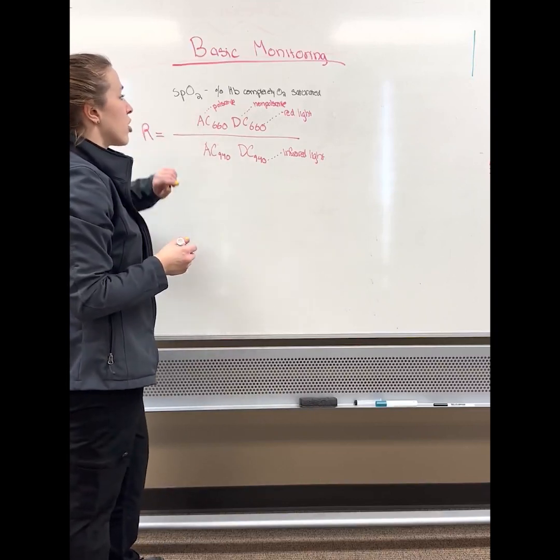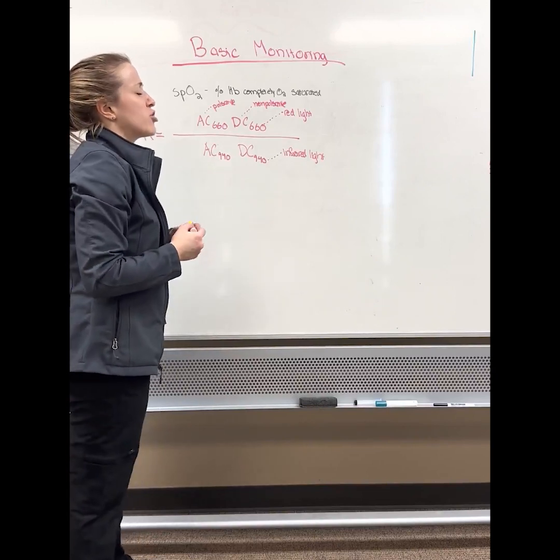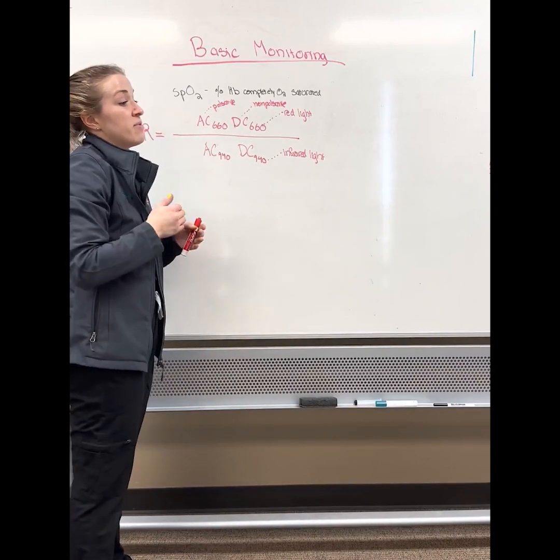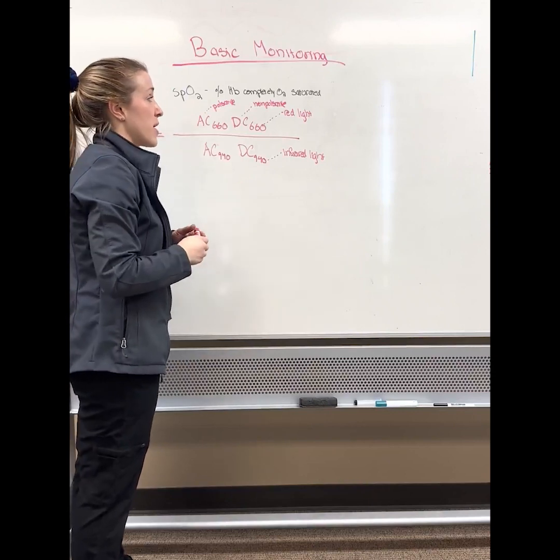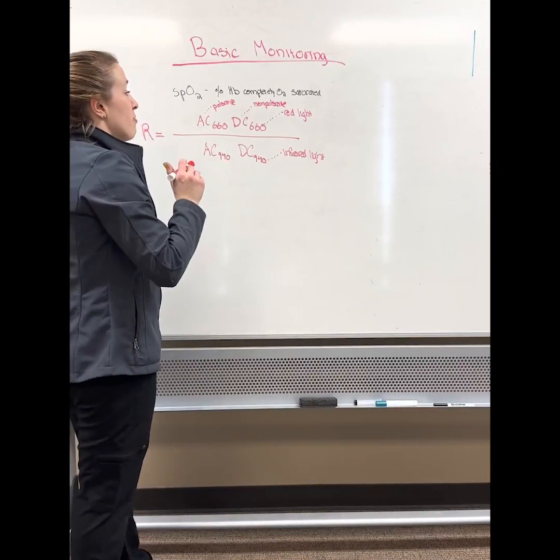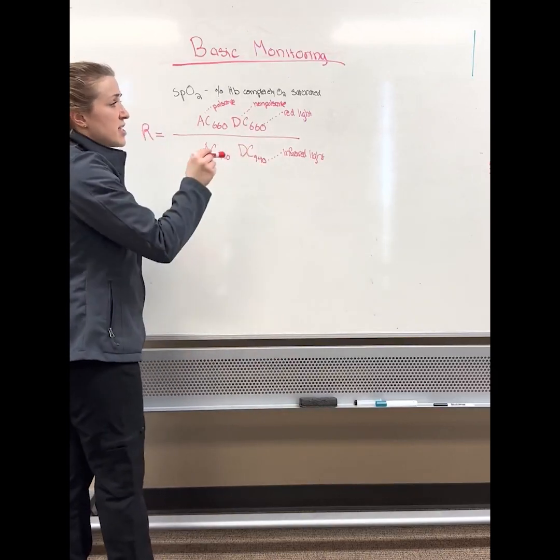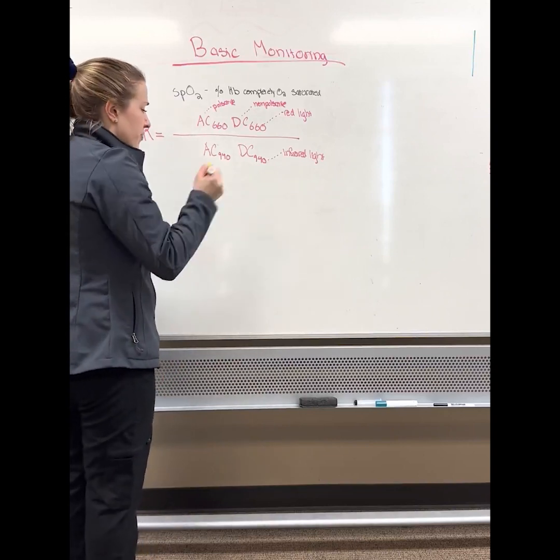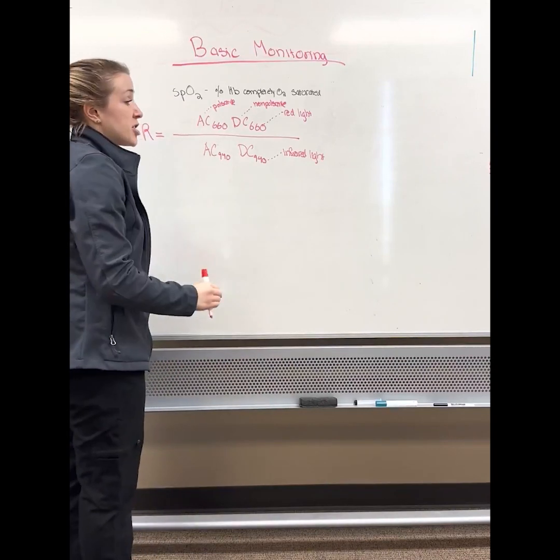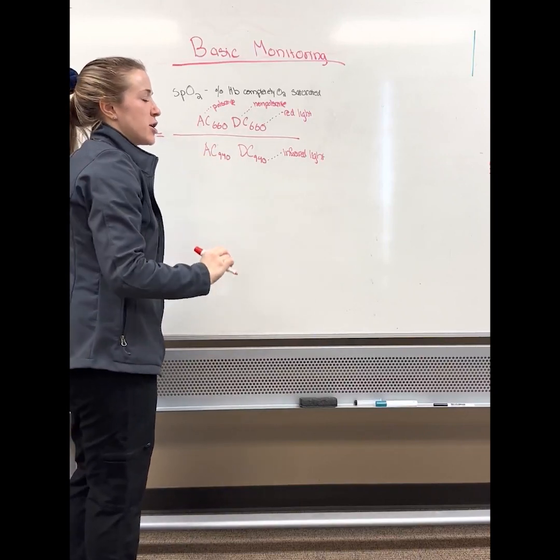The alternating current is what happens during the pulsatile phase of the cycle, and the direct current is the static flow in the arteries. That's what is being measured during that time. By measuring these light absorbances, this creates an equation known as R, or the R ratio. The reason this is important is because the R correlates to an SpO2 percentage.